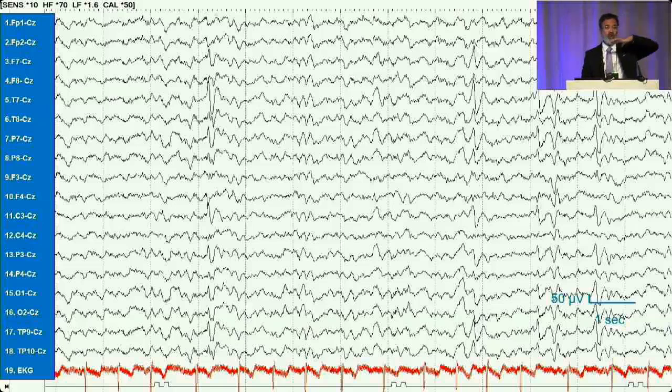You put a whole bunch of electrodes over the entirety of this pebble where it's dropped, and you compare it to an electrode that's distant away, not even seeing any of these waves. So that second electrode, which is held constant, would be measuring the background quiet activity. And so whichever grid 1 electrode shows the maximum deflection is where the pebble was dropped. And it's a beautiful way to really calculate precisely how high the deflection is, because grid 2 is not giving rise to any of that information. It has zero impact on the deflection.